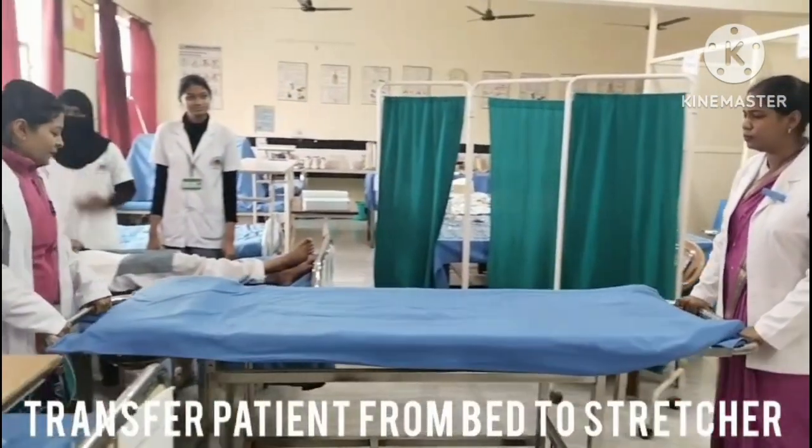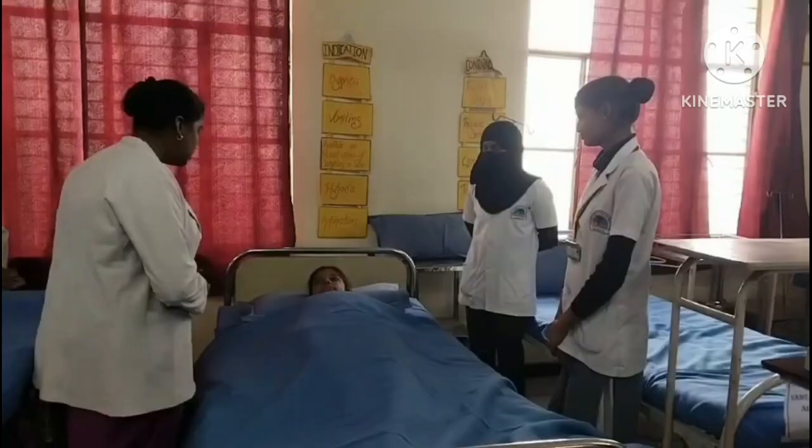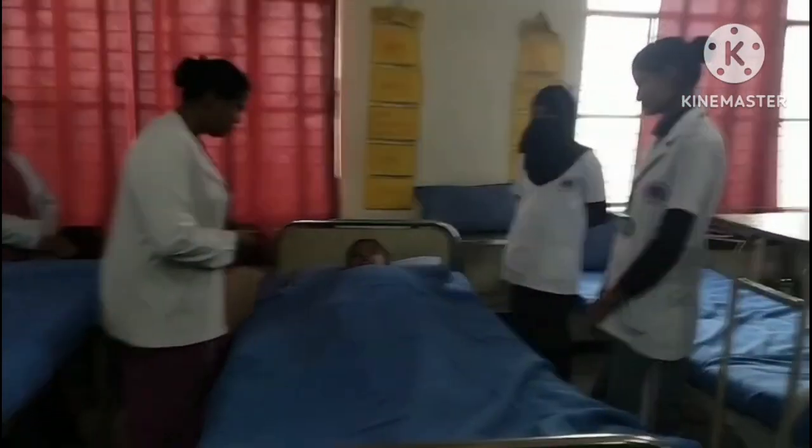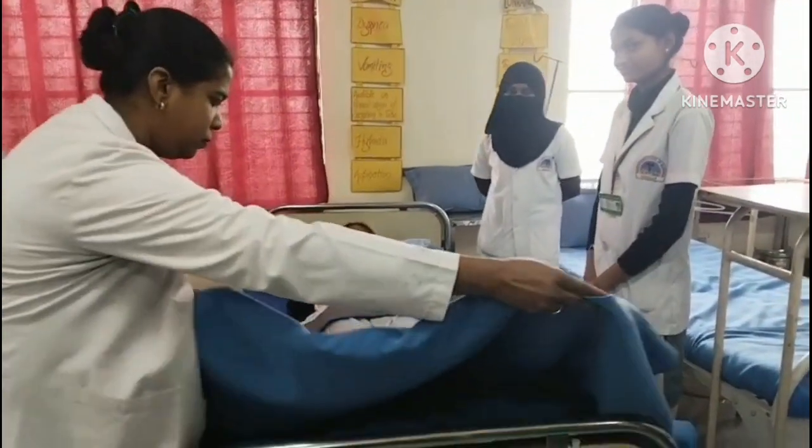Position the stretcher at right angle to the head or foot end of the bed. Call a helper to position them at the bedside along the same side of the bed. Fan fold the top sheet toward the lower end.